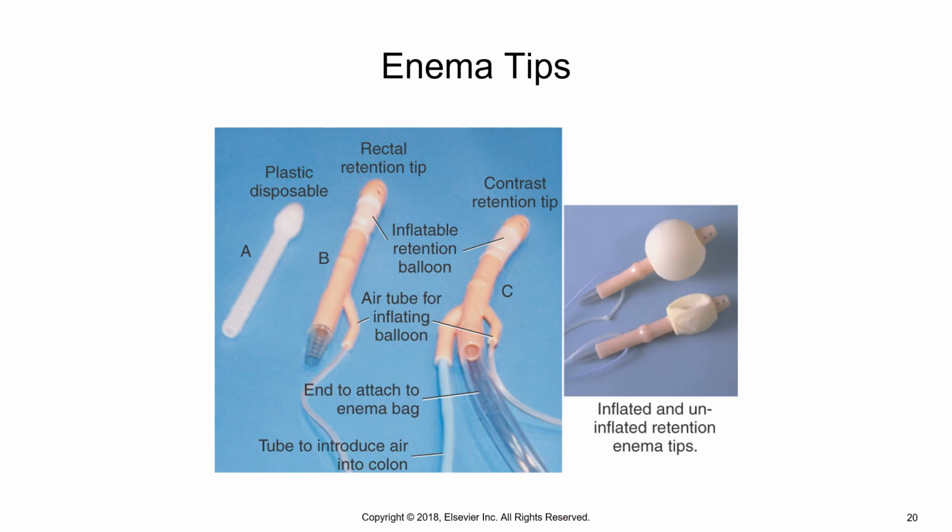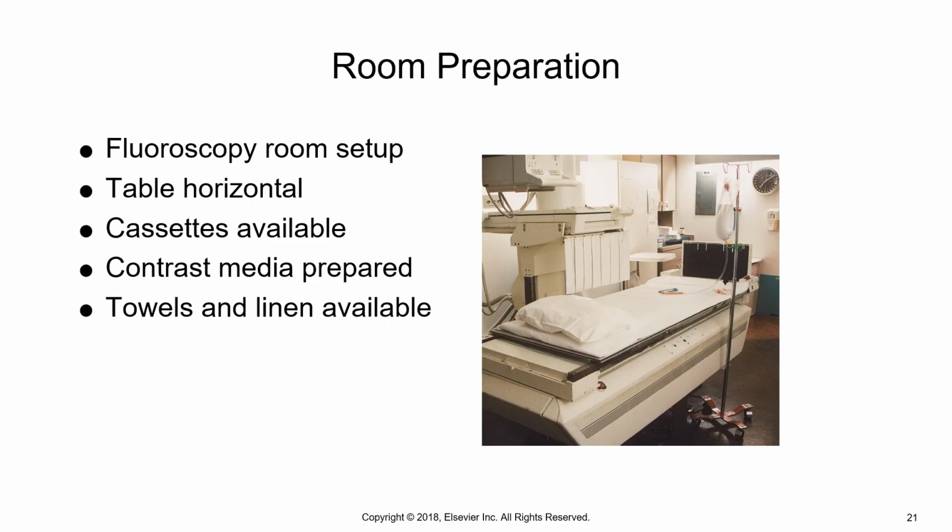And that is something, when you are prepping the room, you do want to make sure that you test that balloon. You would want to fill it with one puff of air and just make sure that it's going to stay inflated, because the last thing you want is to put that in the patient and begin the exam and then realize that there was a hole in the retention balloon.